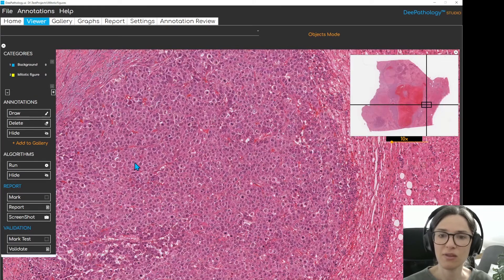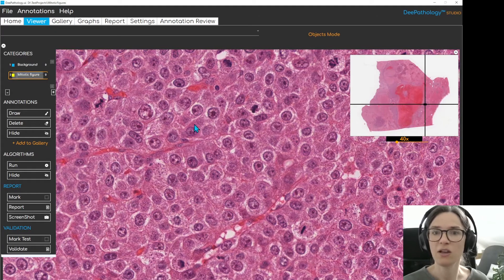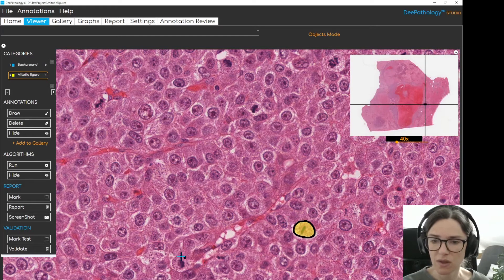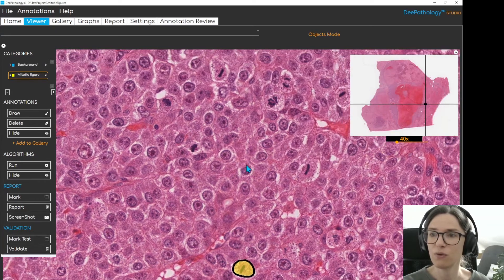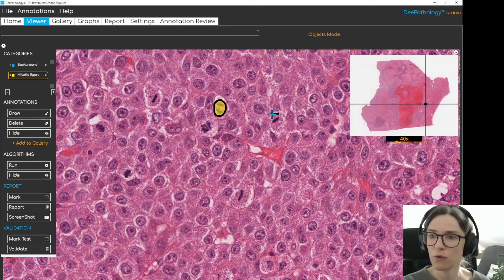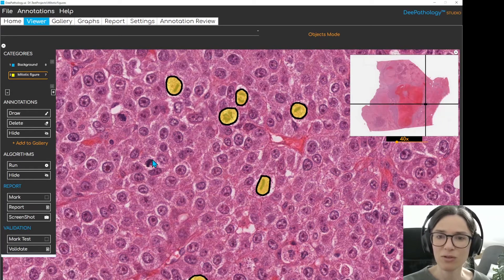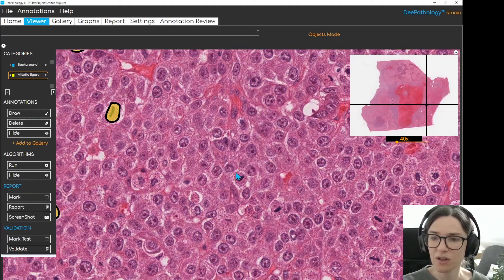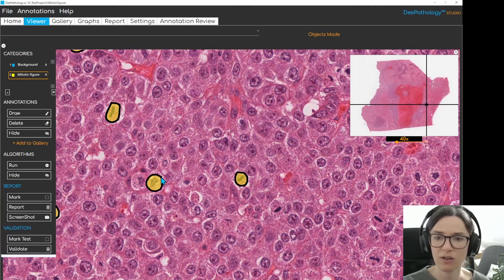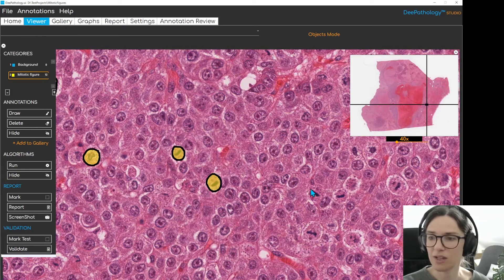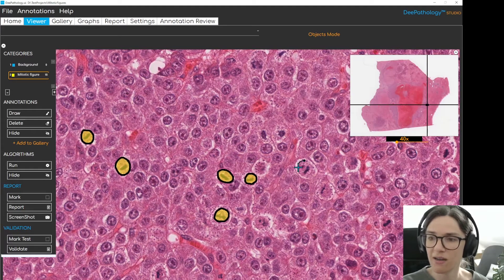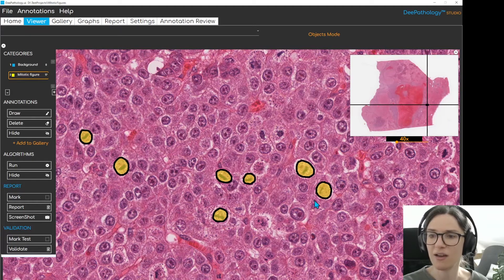I will navigate to an area within the slide where I know there are several mitotic figures. You just have to mark and give a few examples. It's best if you focus on different mitotic figures — some that look different because of the phase in which they have been caught, but also depending on different location and other things — so that you can give a variety of examples for the algorithm to best train to detect all mitotic figures. You don't have to annotate exhaustively; those that quickly catch your eye are a good starting point, and later you can refine the algorithm even more.